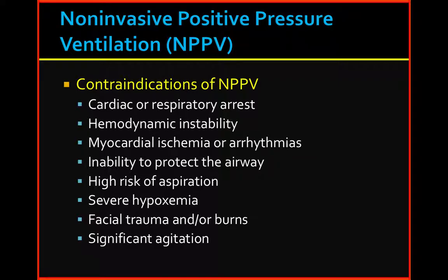You all hear it okay, or turn it up? Got our endotracheal tube. Got our ventilator.